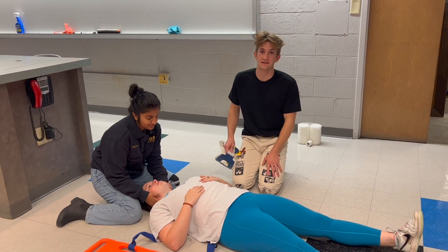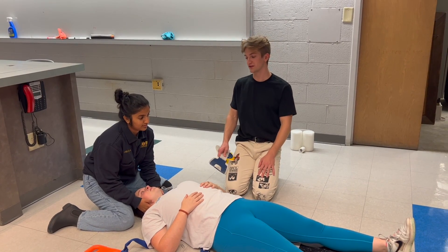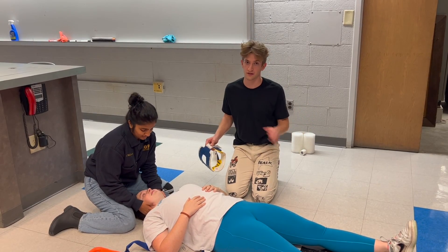Hello, this is a demonstration of a full spinal immobilization. This is a skill that you use when the mechanism of injury is so great that you think there's a bad spinal trauma and you want to make sure that it does not get exacerbated on the way to the hospital.